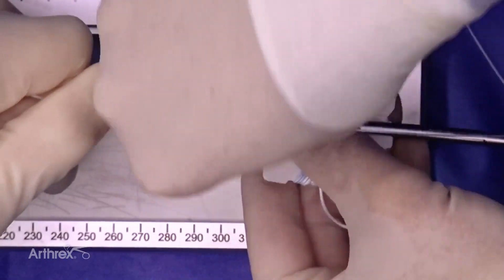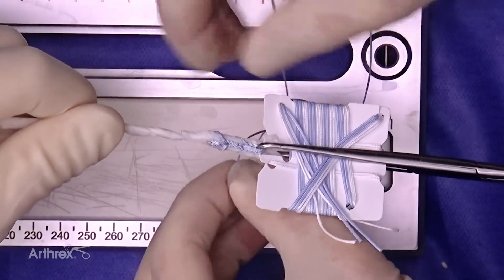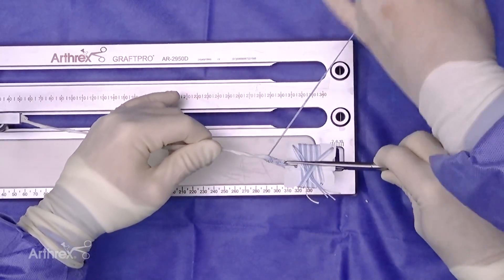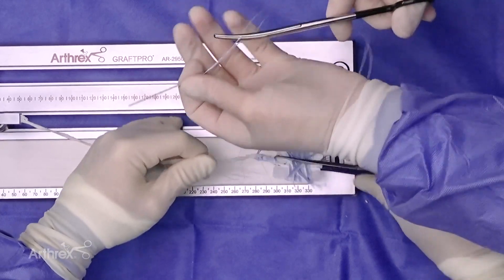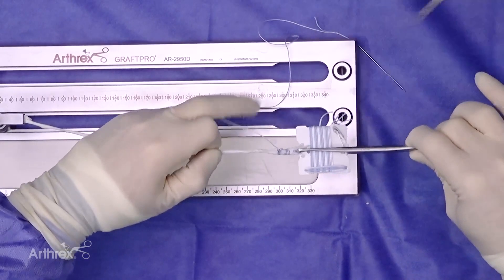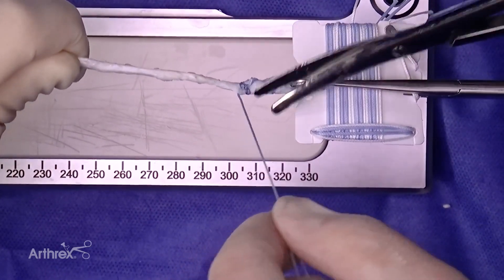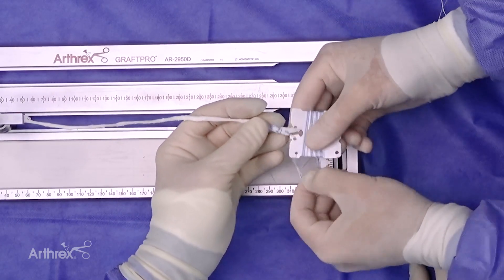The suture is then passed again through the fiber tag in the graft, approaching distally. This allows security of the graft as well as security of the graft to the tightrope. A final stitch is then placed at the end of the fiber tag and graft, completing the loop suture technique. Once this is done, a single limb of the suture is cut, leaving the needle attached to one end. This allows dunking of the previous knot. Once the suture is tied securely in standard knotting technique, the single limb of the suture is cut, keeping the needle attached to the other end. This is then passed through the graft, allowing the knot to be appropriately dunked within the graft so as to not provide any potential interference in the tunnel. This completes the fiber tag security to the triple limb of the semitendinosus autograft.